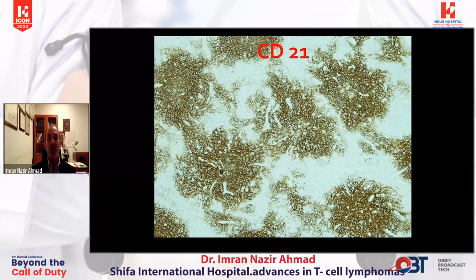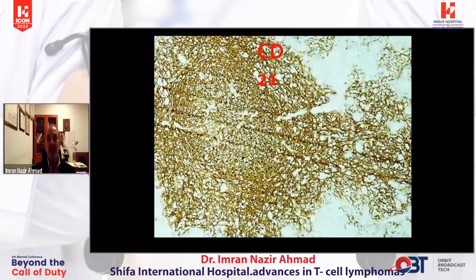As compared to follicular lymphoma, they will have back-to-back follicles, but they still would have round contours, something like that. Marginal zone lymphomas will have expanded meshwork because of colonization by marginal cells, but they still will have well-defined borders. Unlike over here, this is really all over the place. On high power examination, you can see this really extensive destruction of this FDC network.